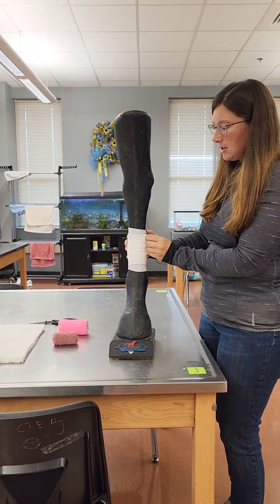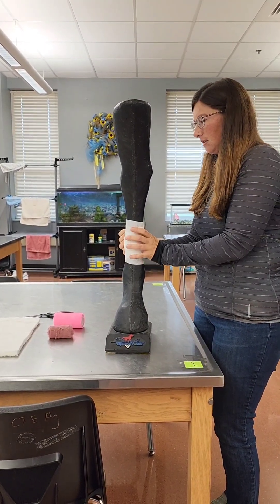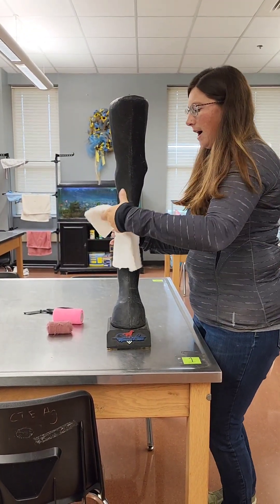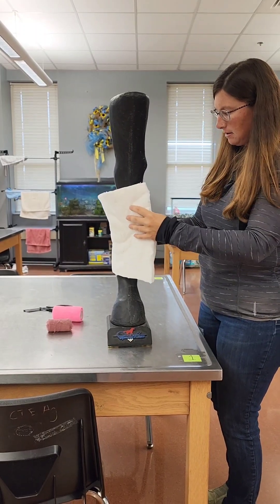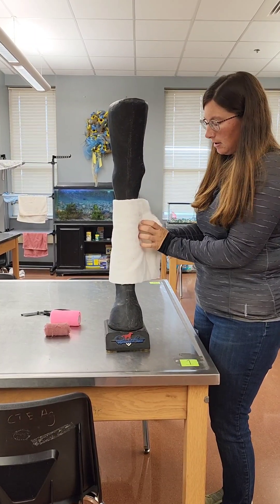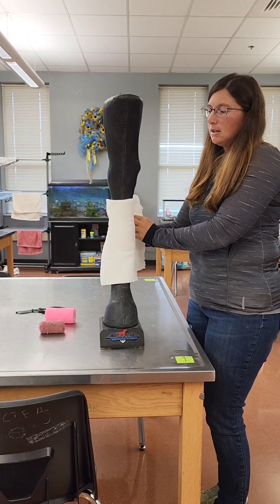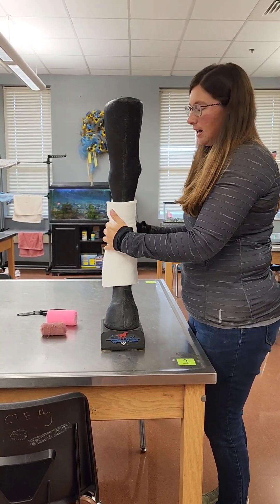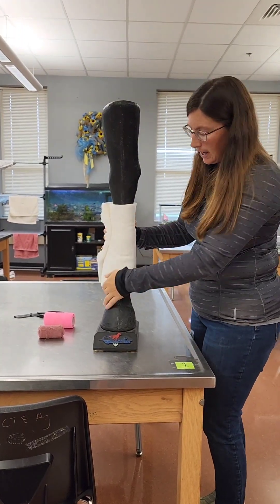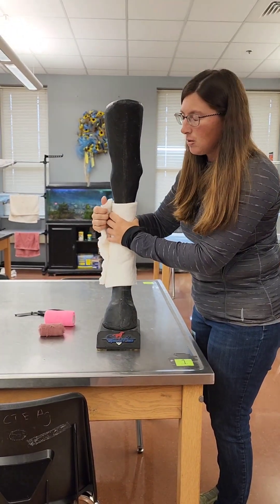Once you have secured your dressing, you are going to use your sheet cotton, wrapping it around the leg. You want to avoid restricting the upper joint, and you're going to apply this similar to applying a quilt wrap for a standing bandage. You want to come around the front of the leg and make sure that it is even and equal pressure.